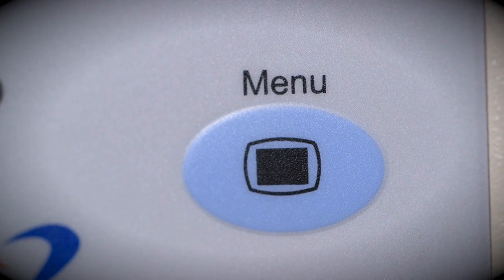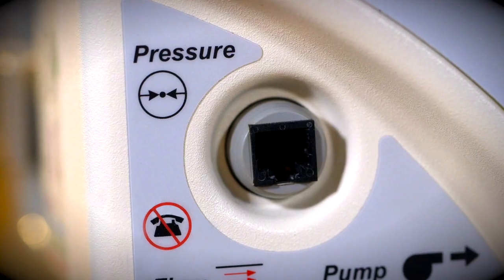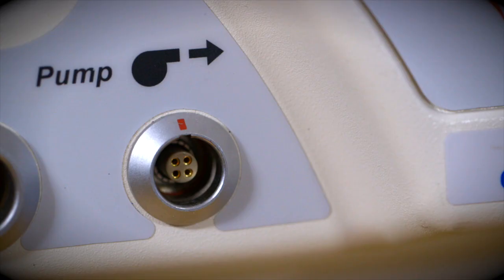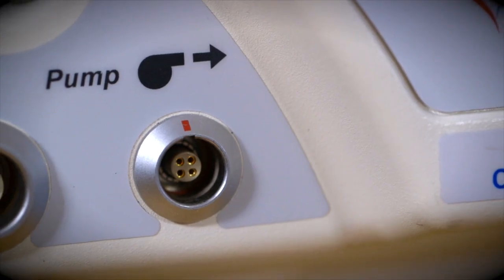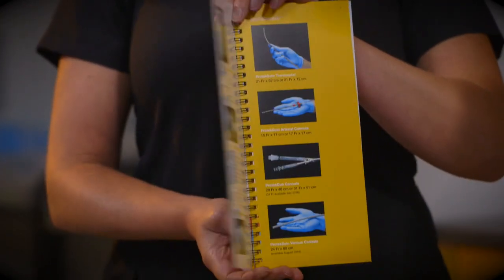On the face of the Tandem Heart Controller, you'll also find the pressure transducer receptacle, the flow sensor receptacle, and the pump driveline receptacle. Refer to the procedure guide for more detailed setup and operating instructions.